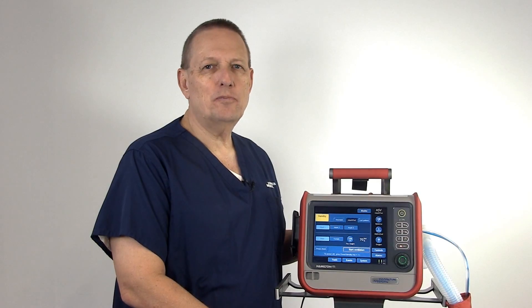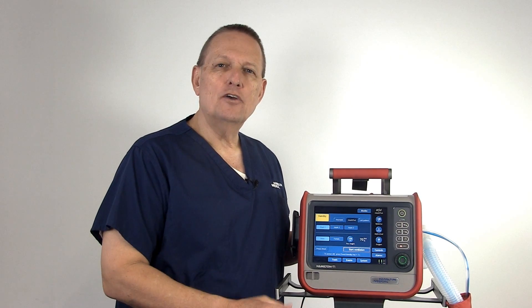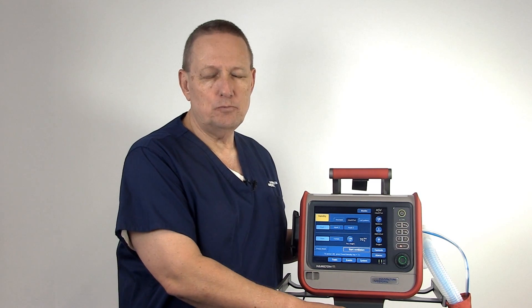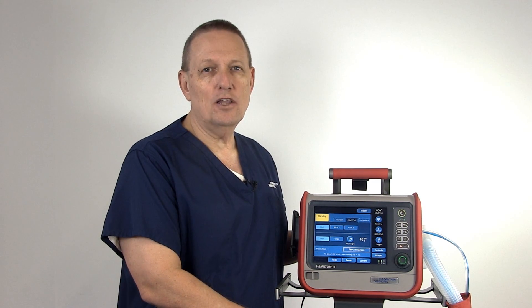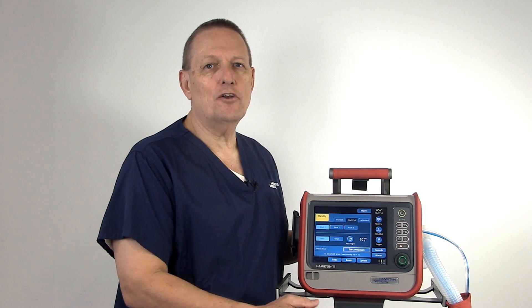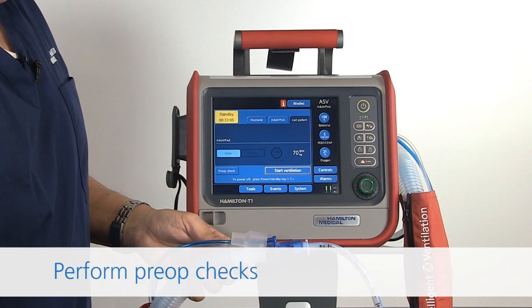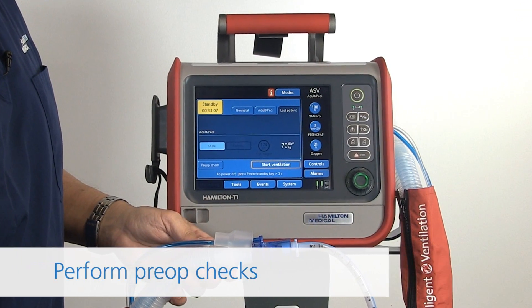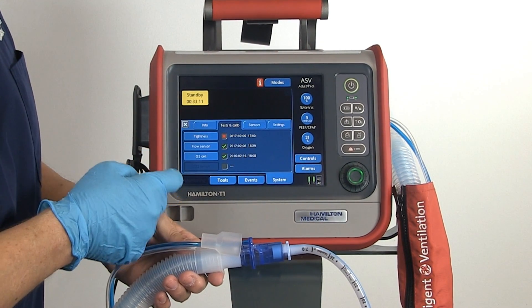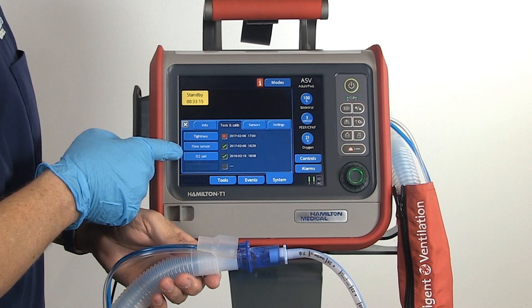You're ready to run the pre-op check. The pre-op check is a tab on the main screen. You run this pre-op check anytime you are placing a new circuit on the ventilator or anytime you're placing the vent on a new patient. We will press the pre-op tab and have our indications for tightness, flow sensor, and O2 cell.